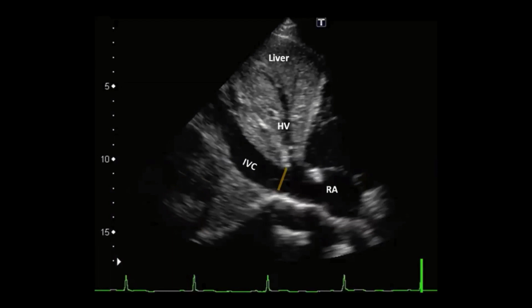And as far as the IVC, which again you're familiar with the subcostal view, it's best done with M mode so that you can see respiratory phasic change.